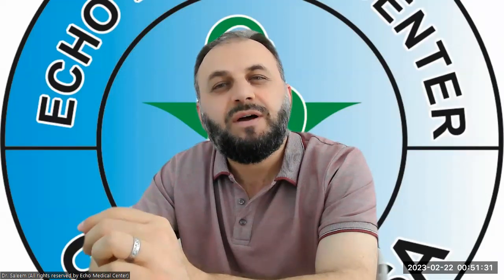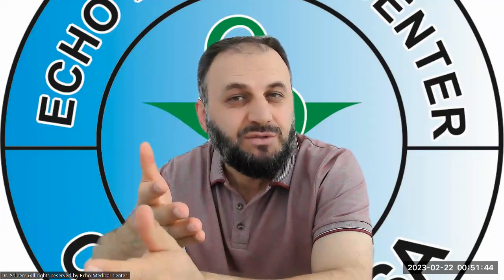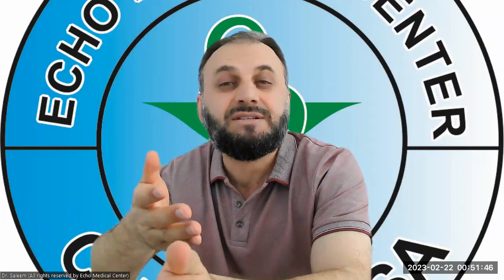So the protocol starts from the CCA. One more thing, it's always bilateral. So our protocol to rule out any arterial disease is bilateral, because you guys know most of these diseases are systemic diseases.